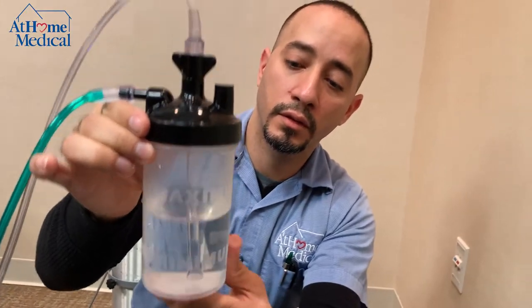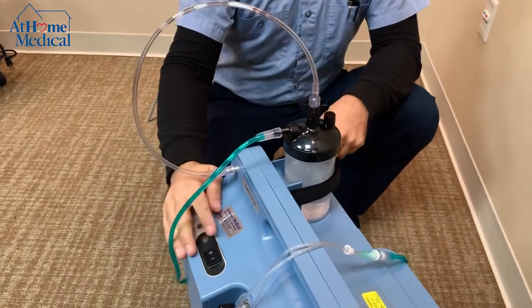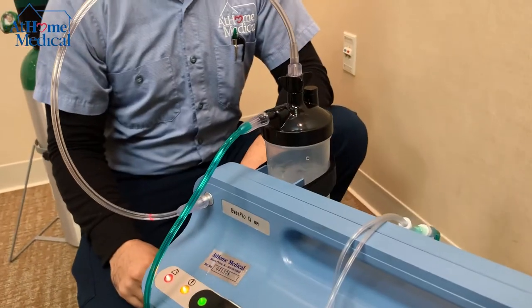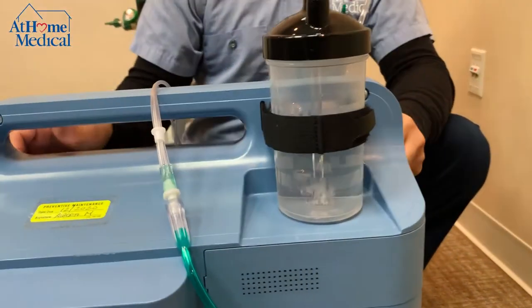When you turn on the unit, you'll notice the humidifier bottle starts to bubble.